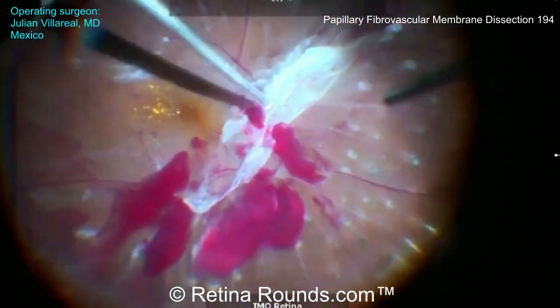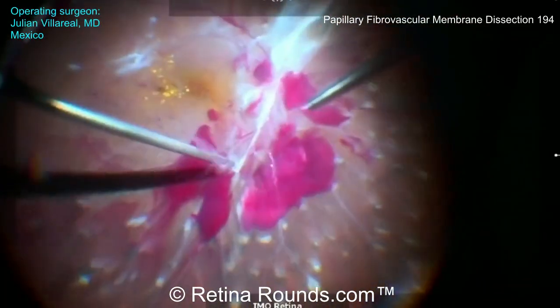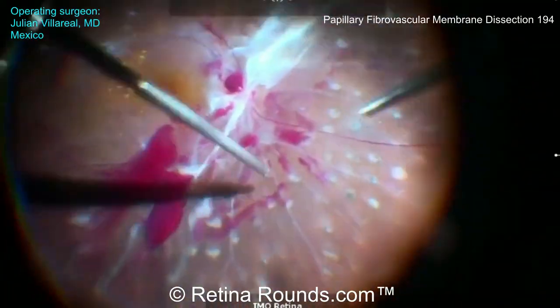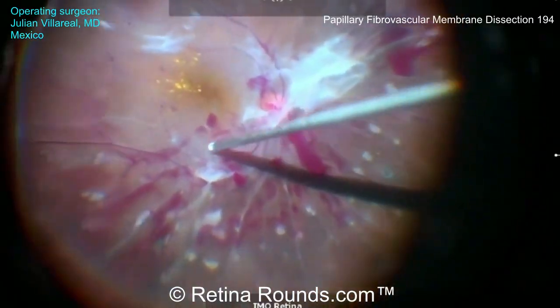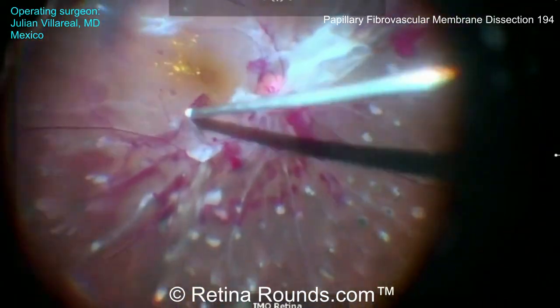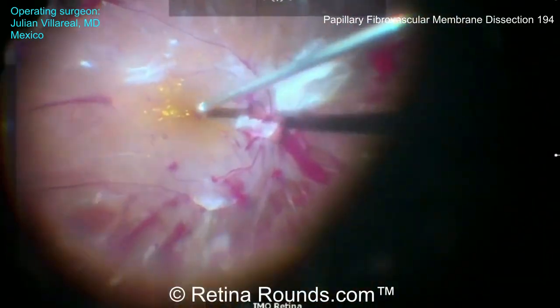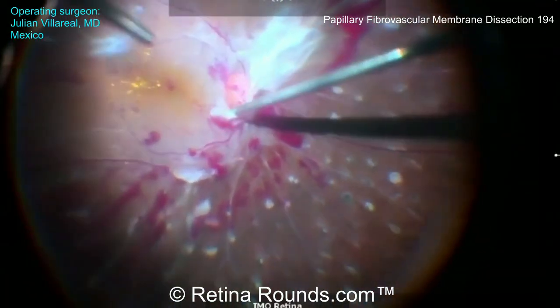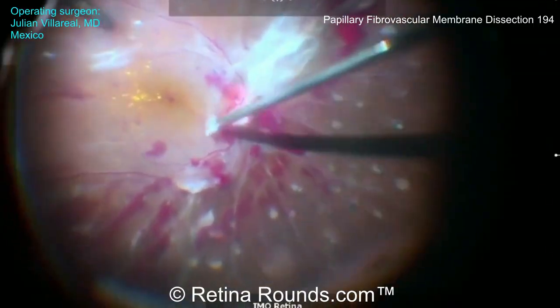An inside-out approach can be a little bit more efficient, since once the hyaloid is elevated in this area, the PVD can more easily be extended, allowing for safer segmentation and delamination of more peripheral membranes. You can see here that he's now accessed the correct surgical plane, elevating the hyaloid over the macula, using the cutter to lift and separate membranes, and is now tackling the membranes that are both on top of and around the optic nerve.